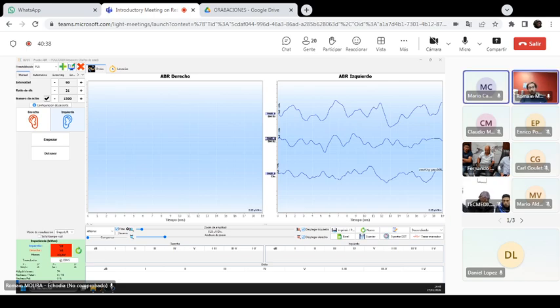Yes, sure. We can give you a license for the audiometry on one device. So yes, you can have the compliance with the tender. It's possible. Because I think we don't need a calibrated transducer, but just allow them to enter into the audiometry page and show them that if I'm activating the headphones, I can move from a range from 125 to 8,000.